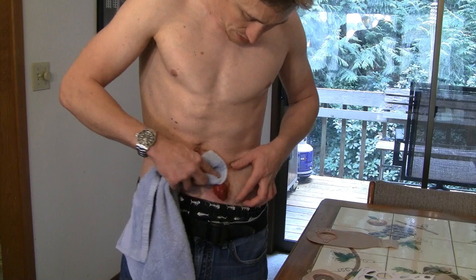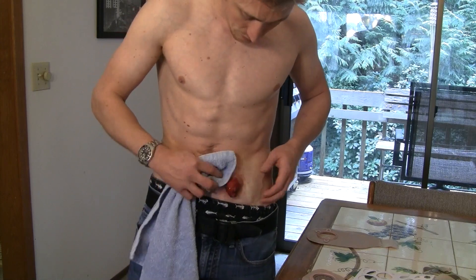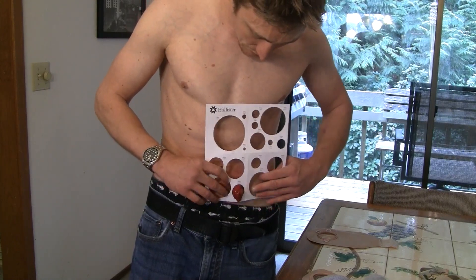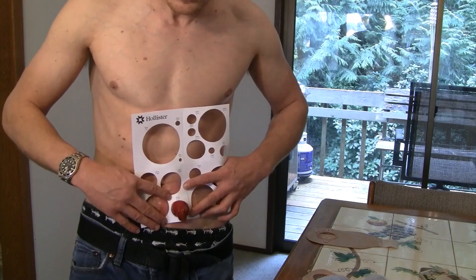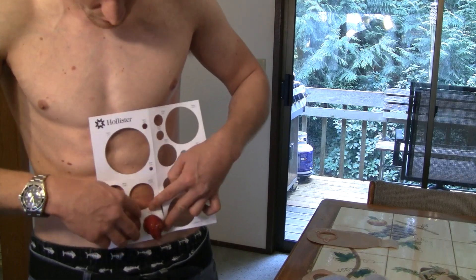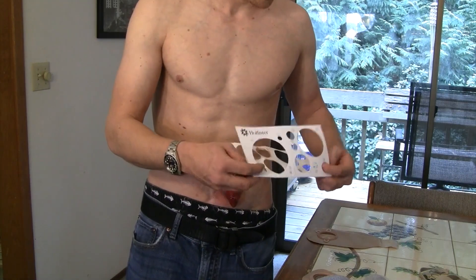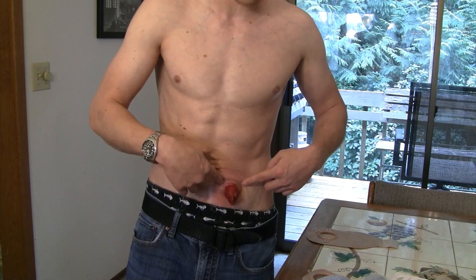I'm just going to clean up the site — my skin is looking a little raw. Basically, I take an eye measurement and put the measurement sheet over the stoma. I look for a little bit of skin showing all the way around. It varies person to person — my stoma balloons out and comes back to the base where it exits the skin.